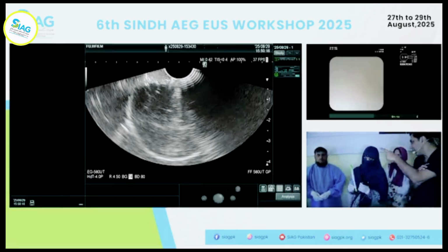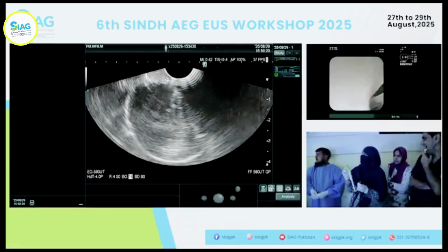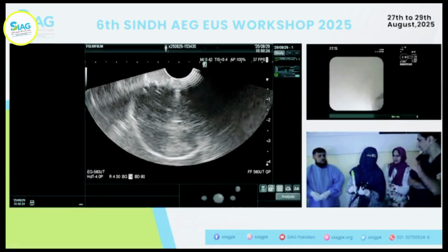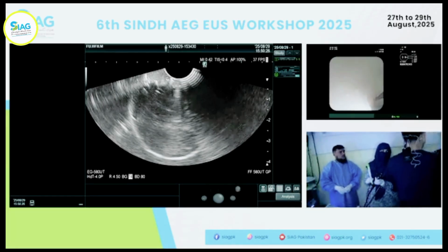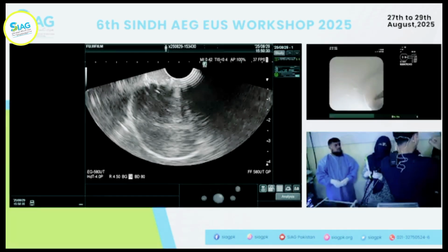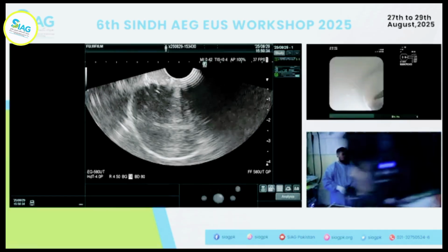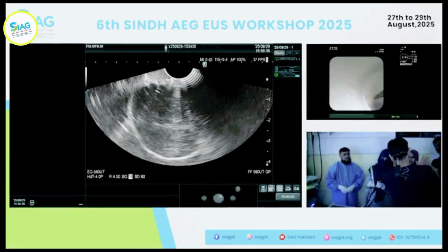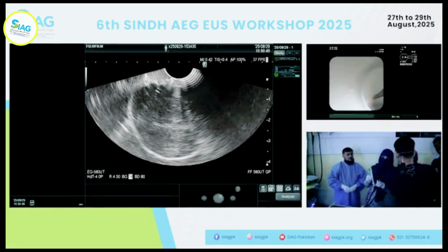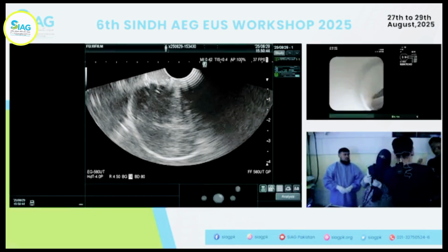I think it's likely there's a mucosal tear. There's a bit of a mucosal tear as well. And this can happen in real life as well. You know, people have caused this. What happens is they don't realize it, okay, and you end up pushing too much of mucosa, you end up causing mucosal tear. So you need enough of the sheath out to make contact with the mucosa, but if you advance too much, it's going to slide. And it's going to slide especially in the stomach, because stomach wall is quite thin, and it's not going to give you that stability.